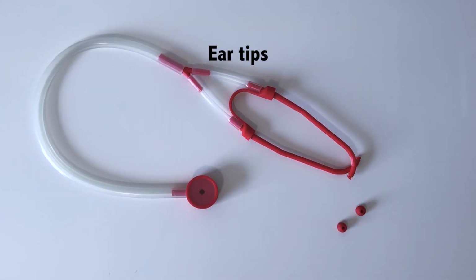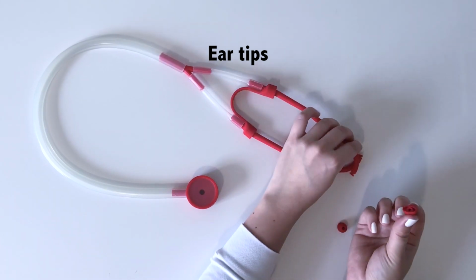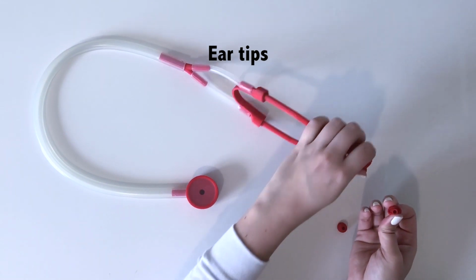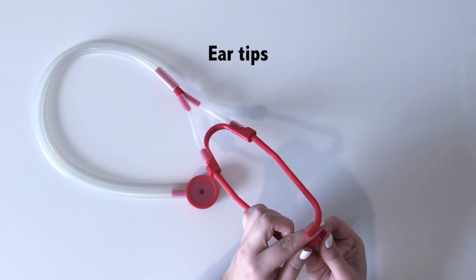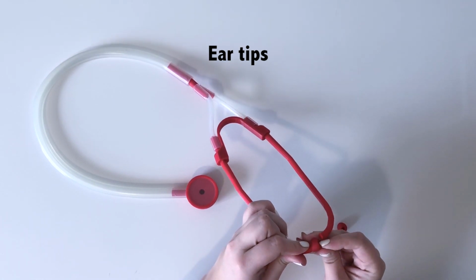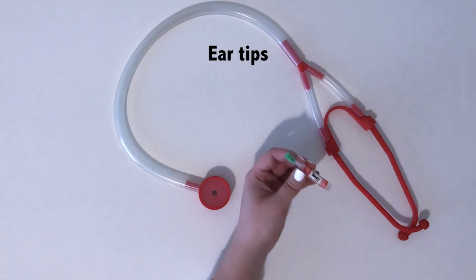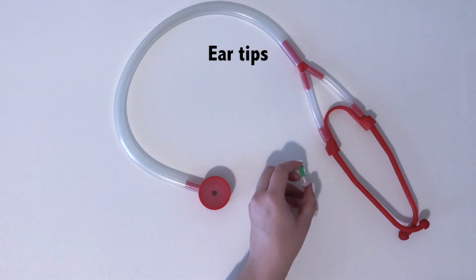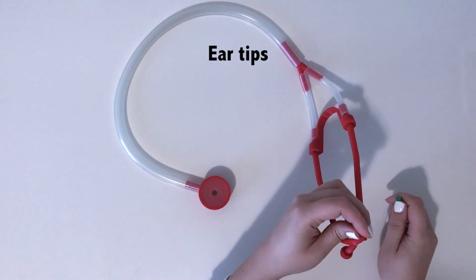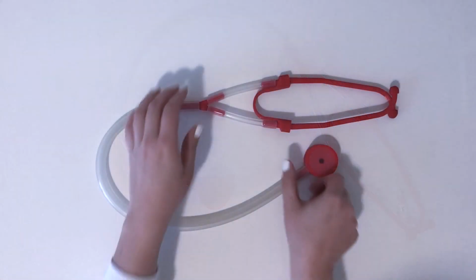Finally, put the ear tips onto the ends of the ear tubes. One technique is to flip it inside out and then place it on the end of the ear tube. It's a good idea to place a small amount of crazy glue onto the inside of the earbud so it doesn't fall off when you're using your stethoscope. And you're done!